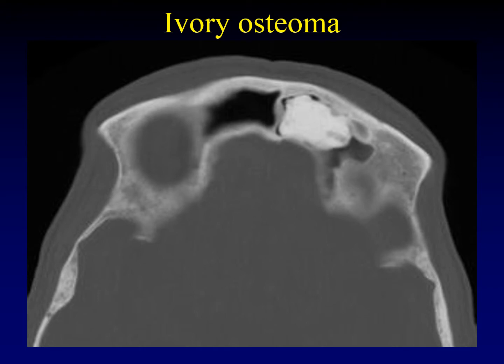Osteomas are bony exostoses that come off of an underlying bone. When an osteoma occurs inside a bone — an enostosis — we call that a bone island. When it extends outside of a bone into an air cell or surrounding soft tissues, we call that an osteoma. There are two basic types of osteoma that affect the paranasal sinuses: ivory osteomas and fibrous osteomas.